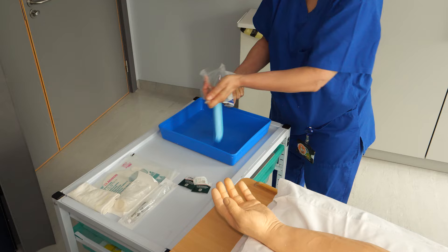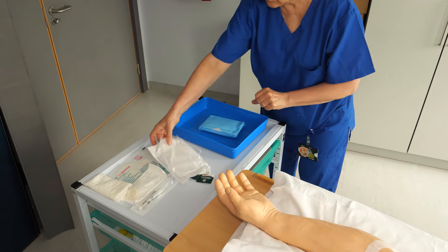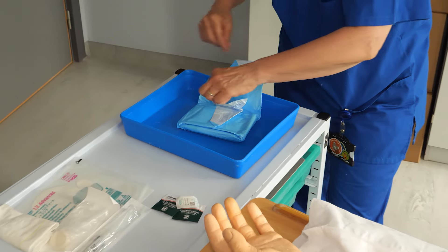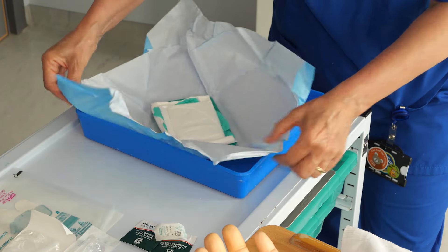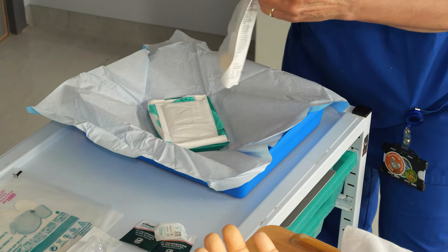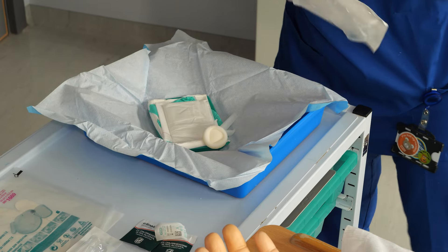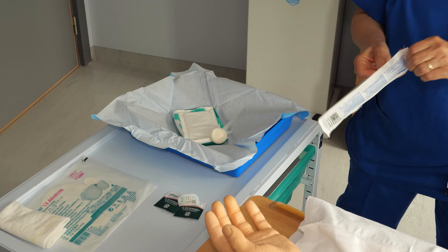Prepare your equipment by dropping it onto your clean surface. Start with the dressing pack — this will give you a lining for the tray. The dressing pack contains an apron, gloves, a blue sheet, a rubbish bag, and a hand towel. Continue to open and drop the other equipment onto the tray, ensuring that you do not touch anything in the packets.